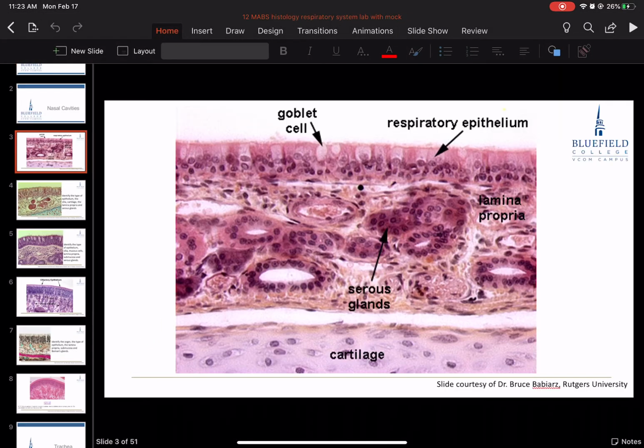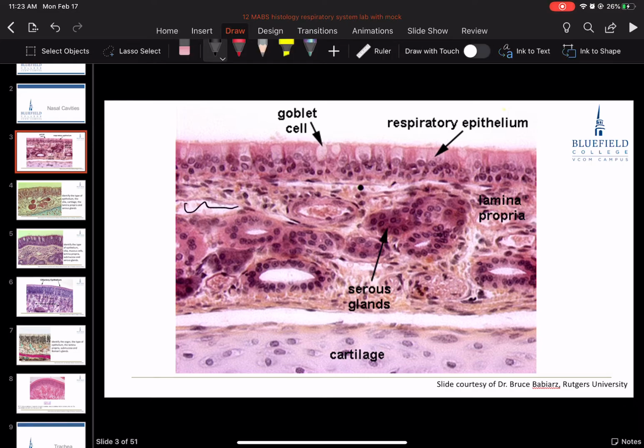Here's that cavernous tissue of vein. Here's another cavernous tissue vein. Probably one right there, it's harder to make out. But, you know, certainly here and here is some of that cavernous tissue.